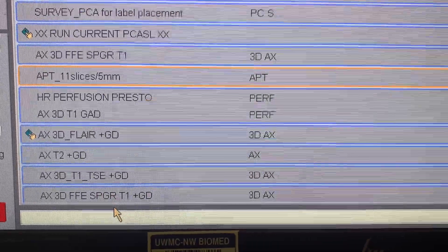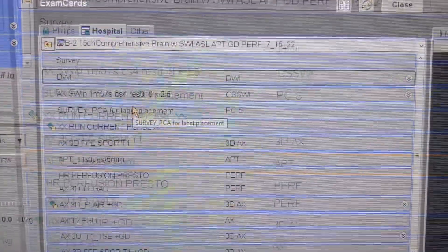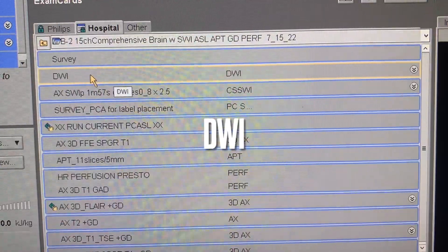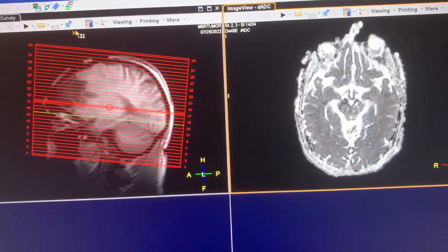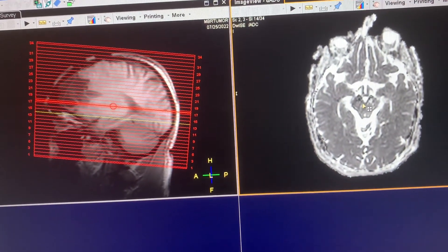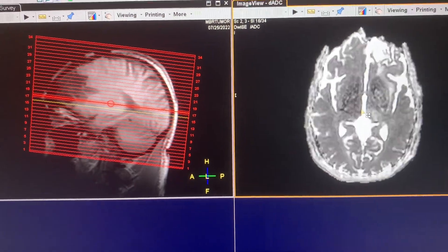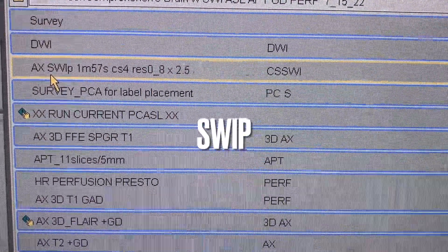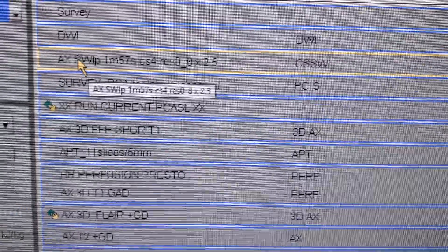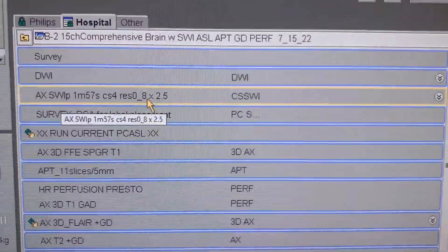Our first sequence is just routine DWI — a regular diffusion covering the entire brain. Let's move on. Our second sequence is SWI, also routine.